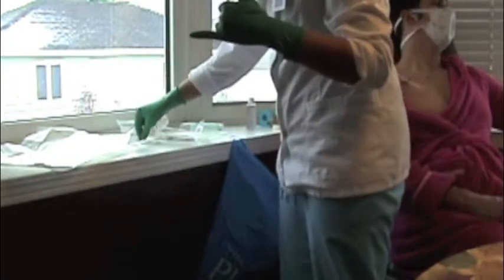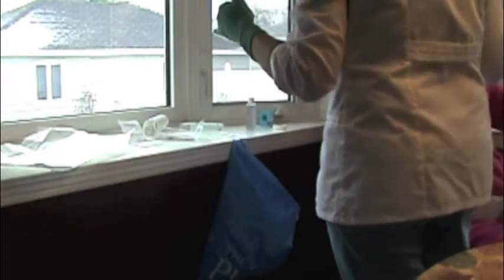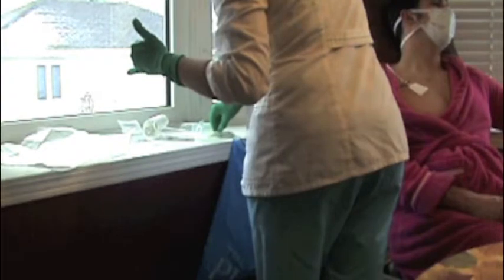All right, it's dry. I'm going to apply my 2x2 right on top of the site there. I'm going to take my Tegaderm. I'm going to remove the film. And I'm going to apply the crease of the top of the Tegaderm to the top of that site there so it can mold to the skin, and the sterile part of the procedure is now over. Sterile area has now been covered. Make sure the Tegaderm sticks nice and down to his skin. Nicely molded.